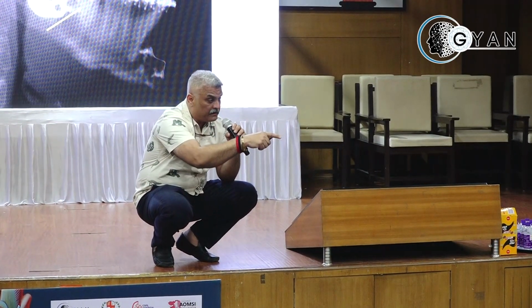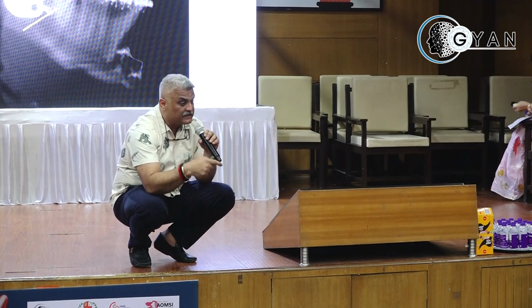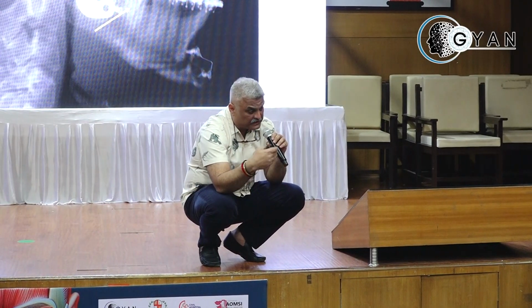When I and Pramod operated a patient for Lauritsen type 2, Andy, you would agree with me, a Lauritsen type 2 patient where there is a zygomatic arch missing, or a Pruzansky, the latest classification. I'm talking about Lauritsen centuries ago. If you speak about a Pruzansky type 2 or type 3 or hemifacial microsomia, where your arch is missing, rudimentary arch, how do you decide where you want to put the fossa? That's where you plan the fossa, mirroring the opposite side, and where do you take the anchorage from? You take your anchorage from the mastoid region. That's called the mastoid anchorage. This is another extreme of planning for syndromic kind of patients. You take a mastoid anchorage, where the fossa is going to be much bigger.